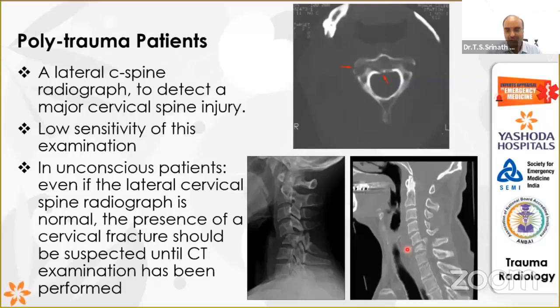You need not manipulate the patient, because if you suspect a patient with a pelvic fracture, or a C-spine fracture, and you have already got these investigations, or you have not got the investigations, it is easy to do a FAST scan and say, okay, there is free fluid in the abdomen, I have to do something next. So that is how it has become a replacement for your stethoscope, and also for your diagnostic modalities.